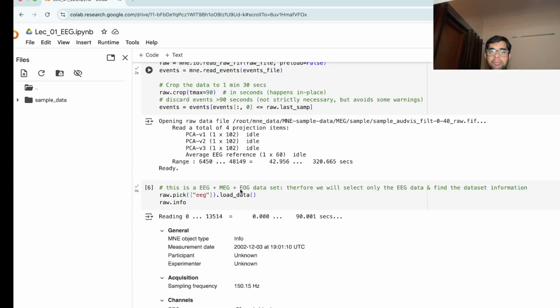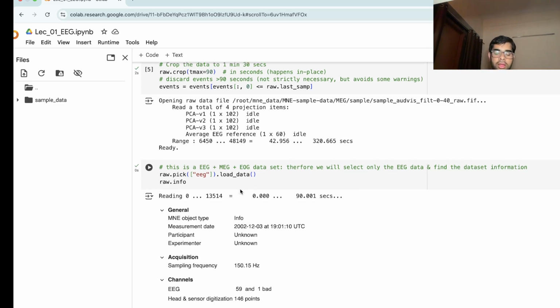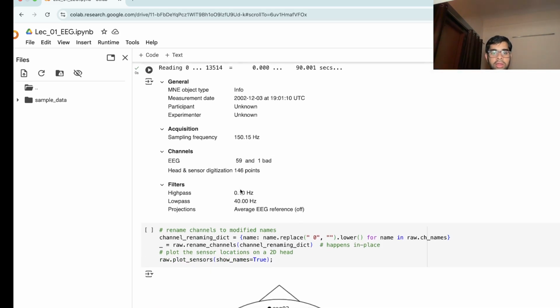So briefly, the task is they are presented with two kinds of stimuli. One is visual stimuli and one is auditory stimuli. Okay. So just that information is enough, and it's a toy data set. It has no hypothesis to solve using EEG or anything else.